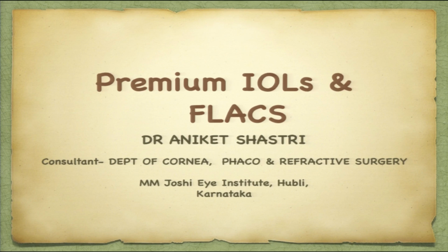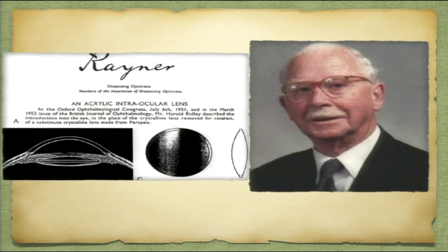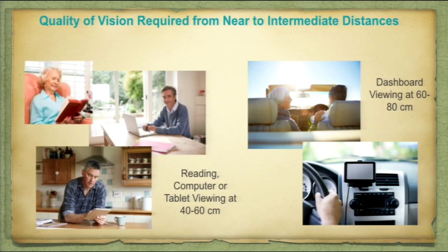So I'll be completing the journey which we started with ECC now. We all know that cataract surgery is rapidly being transformed into a precise refractive surgery, and premium IOLs include any non-conventional monofocal and presbyopia-correcting IOLs. Let's pay tribute to Sir Harold Ridley for one of the most important developments in the history of cataract surgery for the patient.